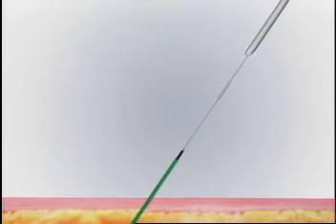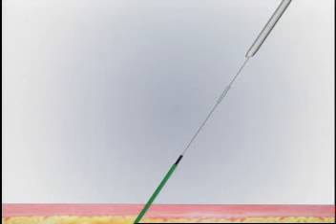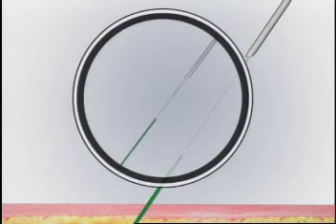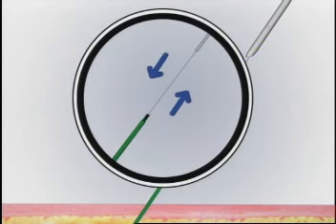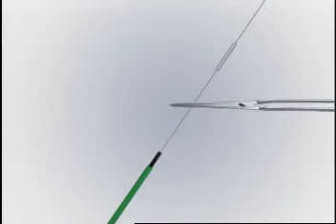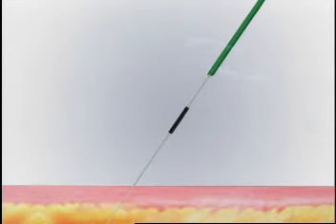A black compaction marker will appear, indicating that the collagen sponge is fully compacted. If the compaction marker does not appear, ease downward tension and wait a few seconds. Cinch again, providing equal tension to both the tamper tube and device. Cut the suture between the black compaction marker and the clear stop. Then remove the tamper tube with a slight twirling motion.